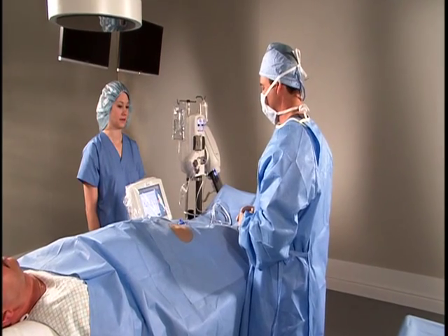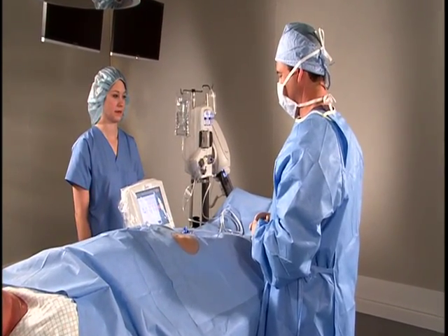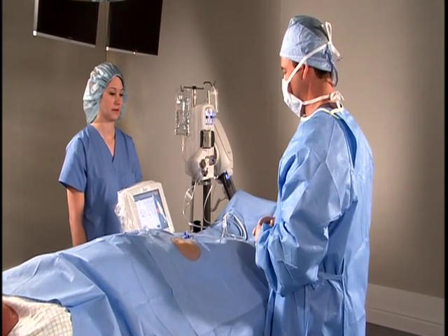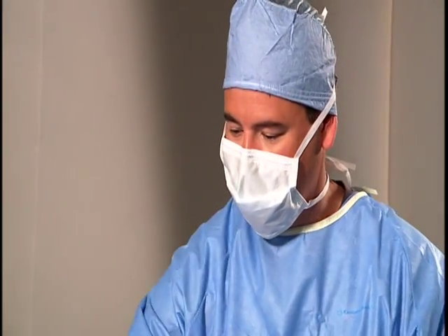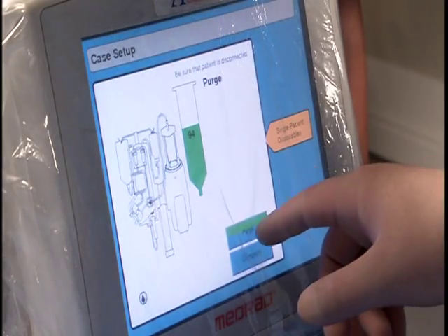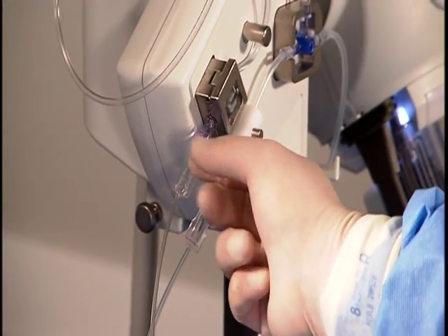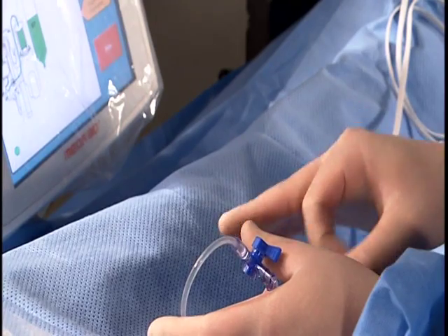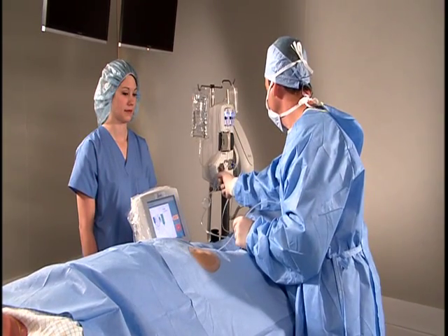When using single-patient disposable AVA500 SPAT-Angio, which is not transducer compatible, perform the following steps. In the setup screen, touch Purge. Initiate a simultaneous contrast and saline purge by touching the Purge button. Flick the SPAT to MPAT saline connection point and waste port stopcock to remove air while purging is in progress. Repeat as needed until all air is removed.